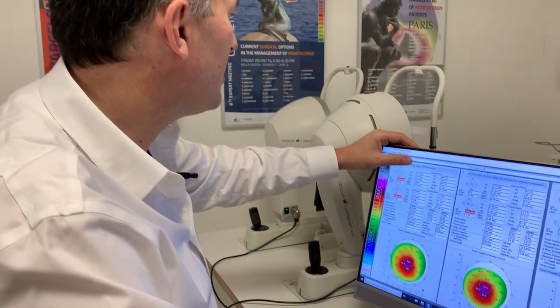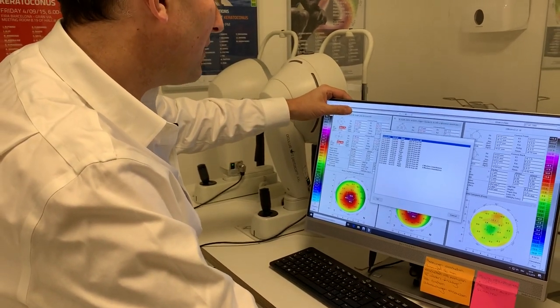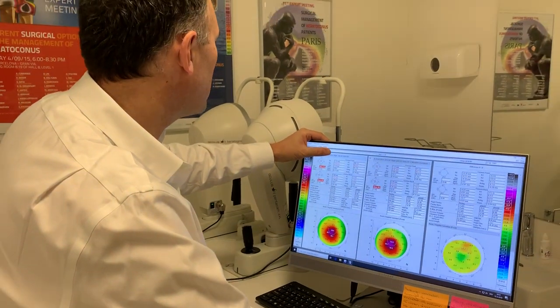I'm very pleased to see that we are among the first to have the new Oculus advanced display that allows us to measure this type of things. The color images that you saw right before were from a Pentacam. As a keratoconus patient, you know these images — they show us the shape of the cornea before and after crosslinking.